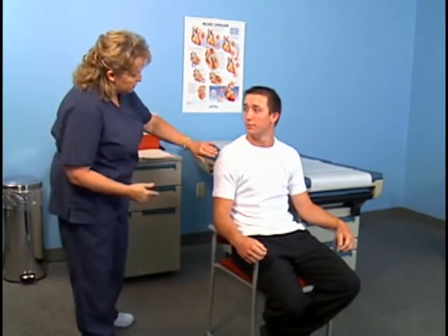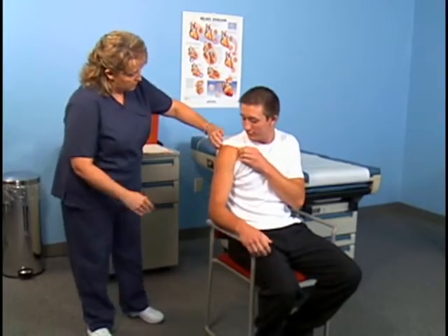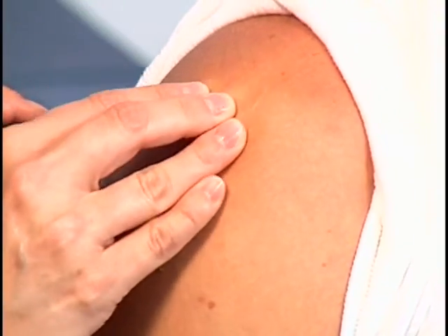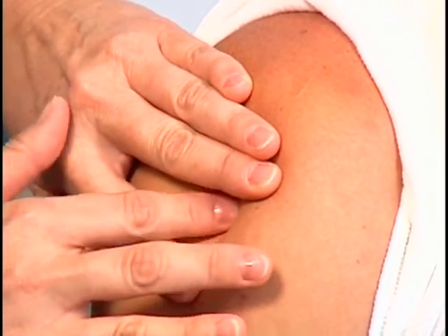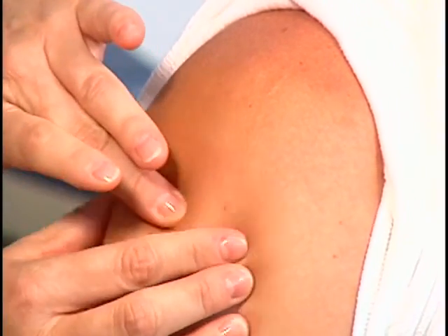Locate the deltoid injection site. Ask the patient to pull up his sleeve to ensure the entire area is exposed. Palpate the lower edge of the acromion process and place 4 fingers horizontally across the deltoid muscle. The site is located 2 to 3 finger widths below the acromion process.